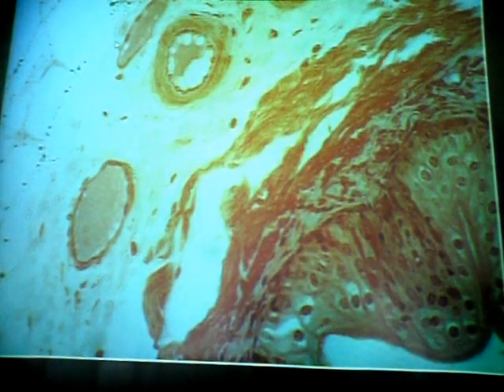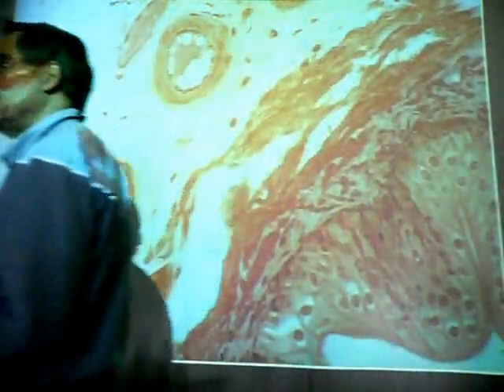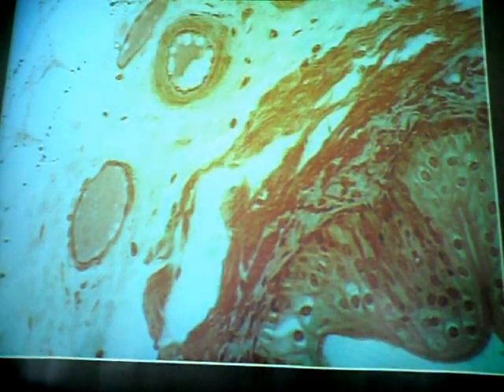connective tissue. Yes? Did you call the lamina propria the submucosal membrane? Did you refer to that in that name? No, it's not submucosa. It's just called lamina propria. And remember, the submucosa is different than the lamina propria. That's actually part of the mucosa, lamina propria. It's the mucous membrane. So you've got your epithelium and your lamina propria, all part of the mucosa.